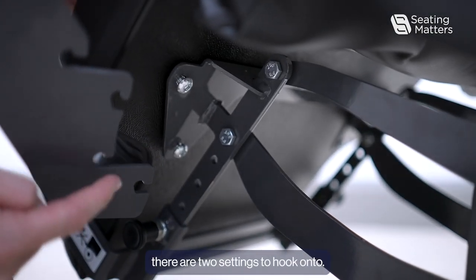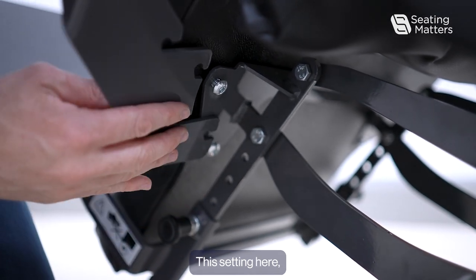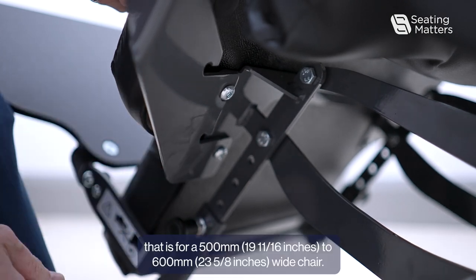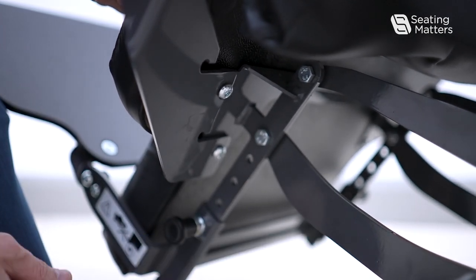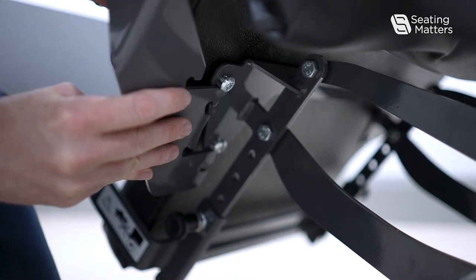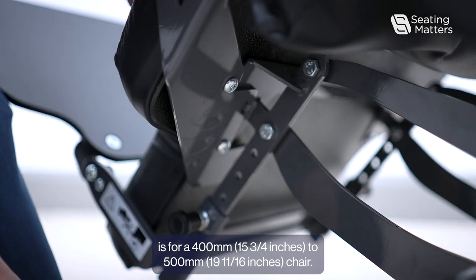On the frame of the leg lateral, there are two settings to hook onto. The outer setting is for a 500 to 600 wide chair. The two inner ones are for a 400 to 500 wide chair.